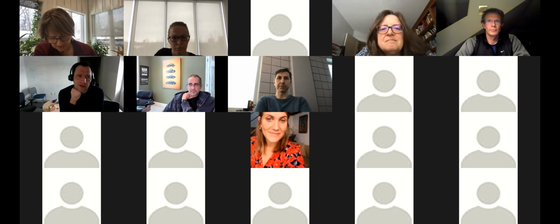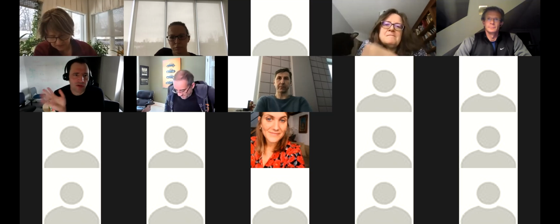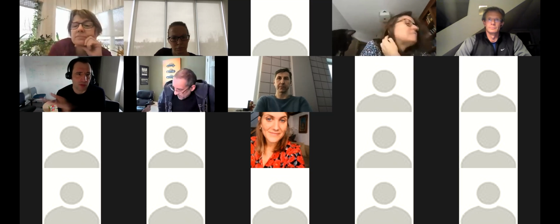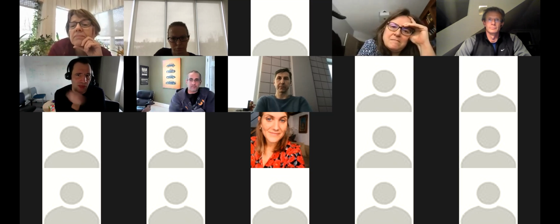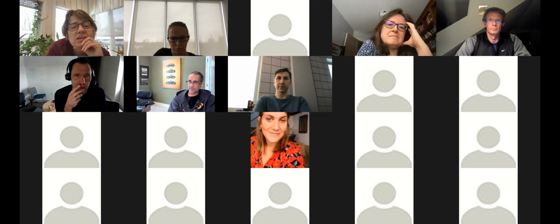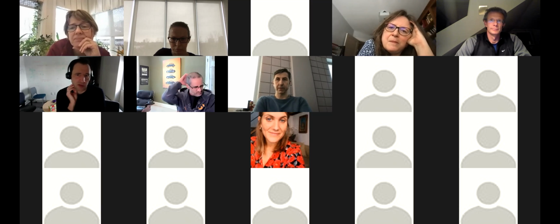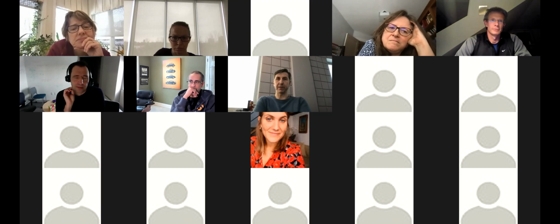Just to understand the trade-offs here, multi-echo just works with multi-slice and in-slice acceleration smoothly, basically. There's no extra interaction cost between the two, right? No, there should be no other interaction there. So k-space undersampling and multi-slice is totally fine. That works okay, just with the regular artifacts that you have with slice and in-plane acceleration.